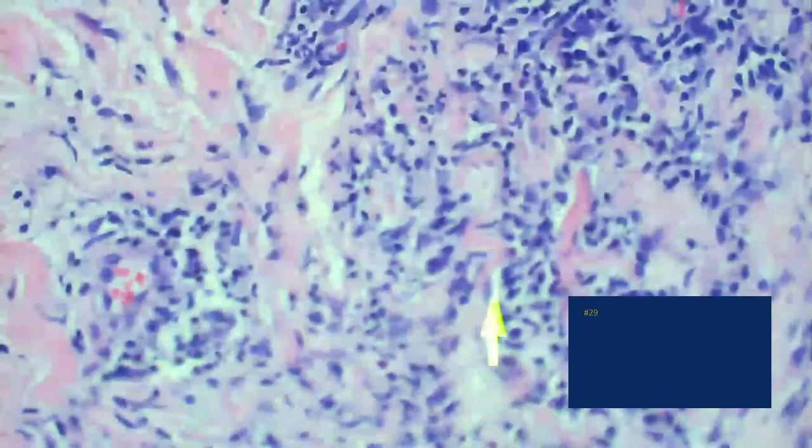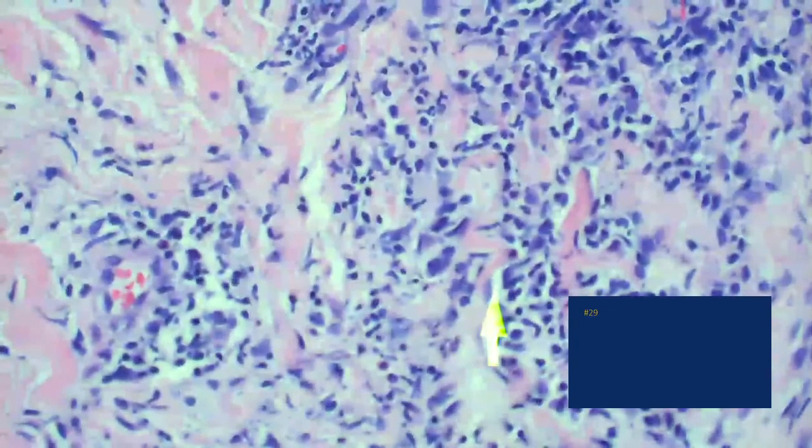Inflammation around the follicle there. There's a little bit of follicular involvement. It's also superficial and mid to deep. And what are these cells? Histiocytes. Some are. And lymphocytes. And any other cell? Some eos, and plasma cells, or eosinophils, neutrophils, plasma cells. Mixed infiltrate.